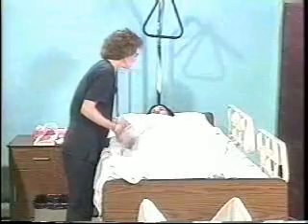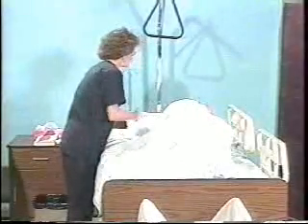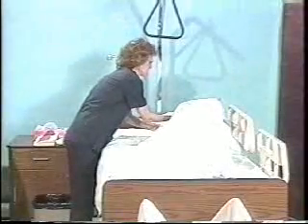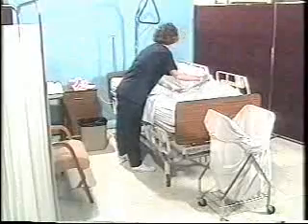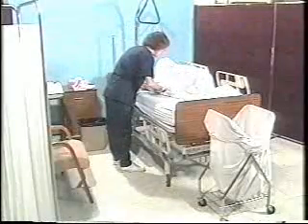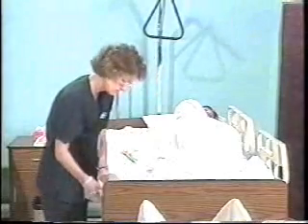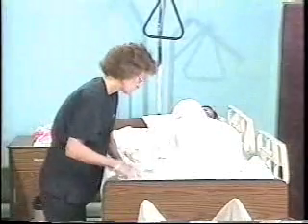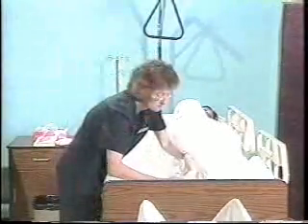Next, she makes sure that the mattress is at the head of the bed and positions the patient on the far side of the bed, making sure the pillow stays with her. She loosens the linen from the head to the foot of the bed. The caregiver notices blood on the draw sheet, which will need to be reported to the nurse. Starting with the cotton draw sheet, the caregiver rolls each piece of linen towards the patient's body.